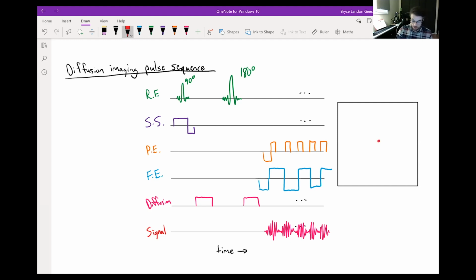We start in the middle of K-space. We're going to move down to the bottom left thanks to that first negative phase encoding lobe and frequency encoding lobe. We'll get rid of this one, just so that our trajectory actually makes sense. So we have our negative lobes to move us down in K-space, and then, thanks to that first positive frequency encoding gradient lobe, we're going to move across K-space on the bottom to acquire our first echo.